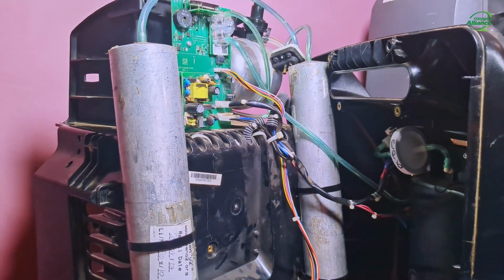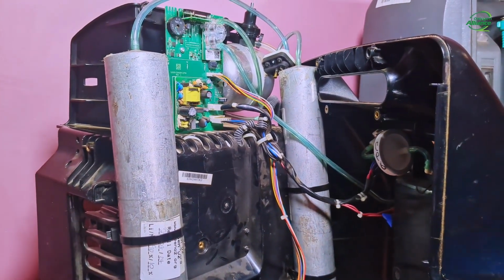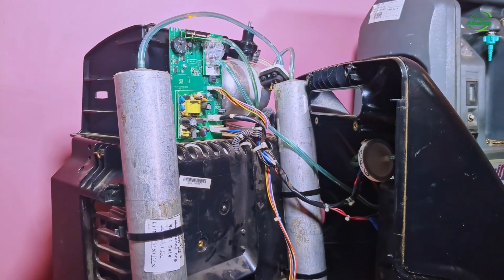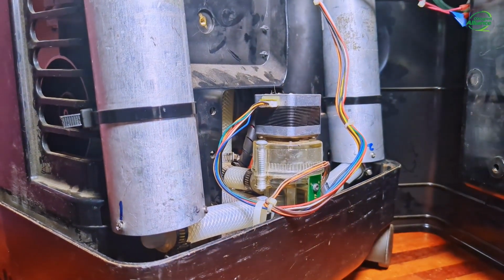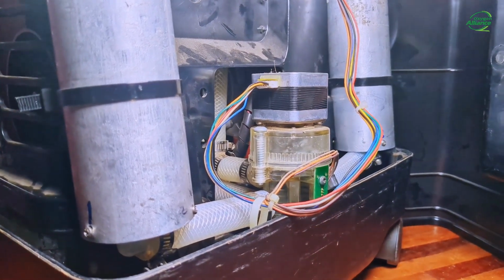After that, I will then switch on the concentrator to see if that fixes the service alarm. You can now see that the valve is rotating properly, unlike when the wire harness was not connected properly on the board.